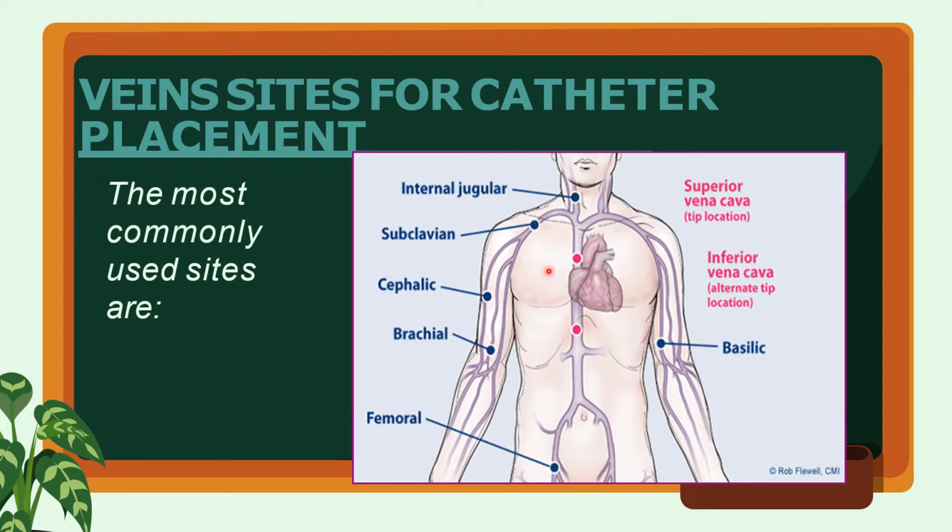For patients with severe hypoxia or hemostasis disorders, the femoral approach is associated with an acceptable rate of complication, especially when the catheter is inserted under strict aseptic conditions.